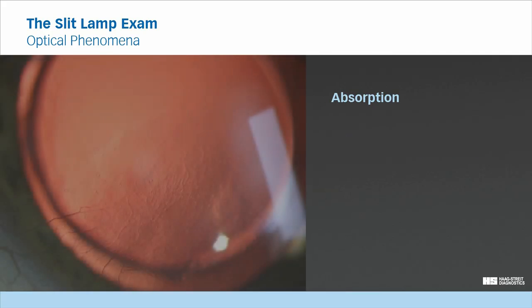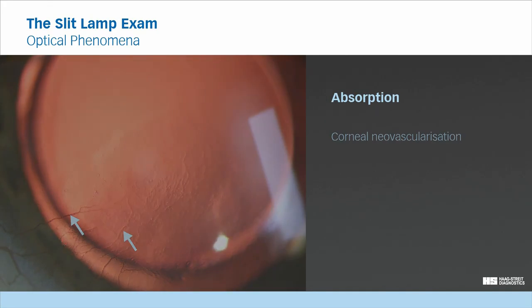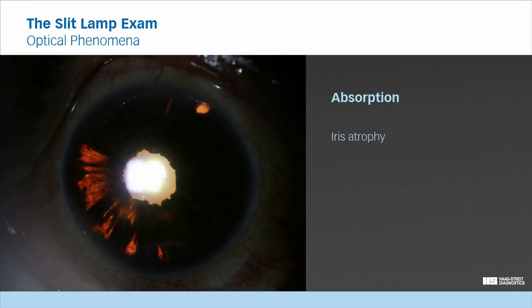During slit lamp examination, this phenomenon can be used for assessing subtle changes. In this case of corneal neovascularization, it allows to distinguish perfused vessels from empty vessels. Or it can demonstrate an iris atrophy by trans-illumination.